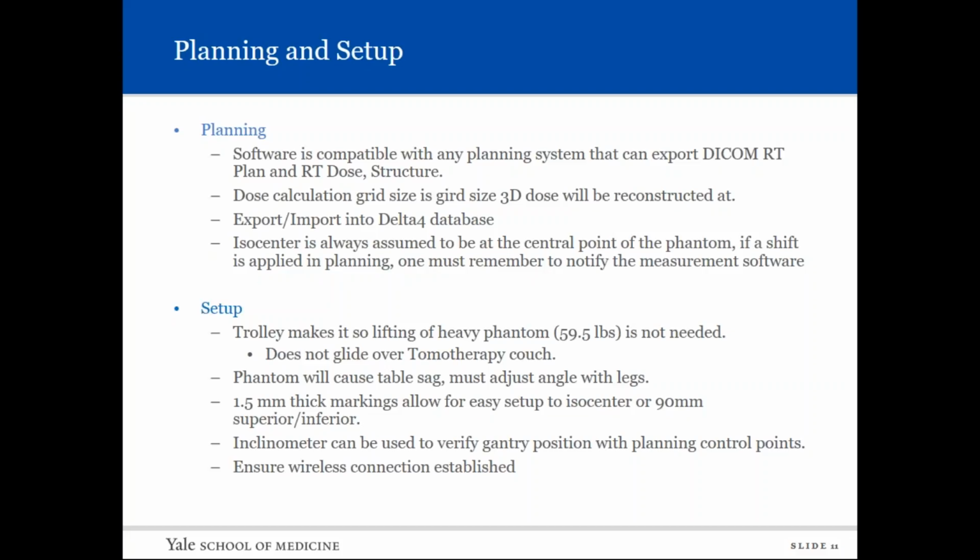In some plans it might be necessary to apply a shift to the Phantom. When you are applying this shift, you have to remember, after you import the plan into the software, to notify it that there's a shift. It makes sense after you do it, but it's not always intrinsic the first couple plans you do, or if someone without much experience is running the software.